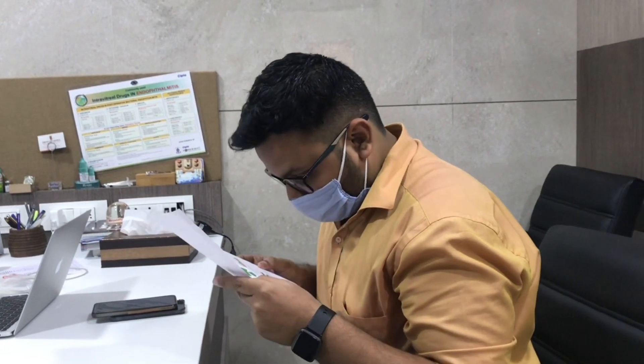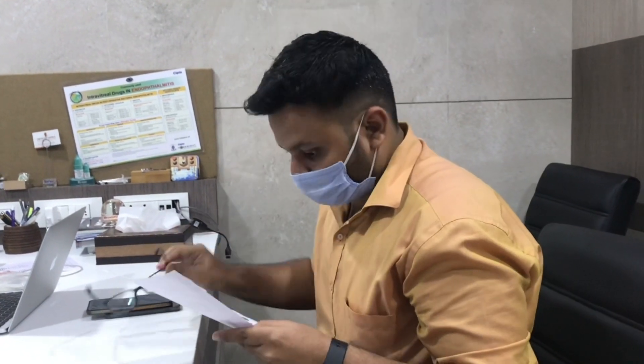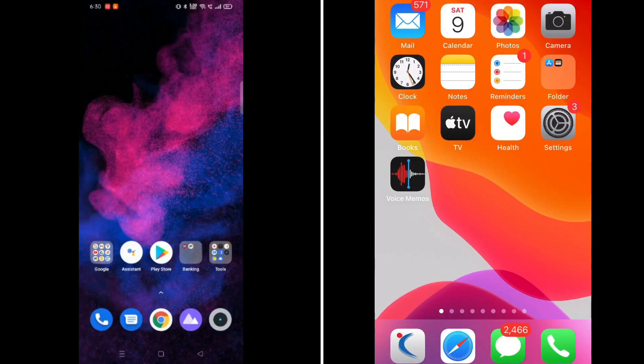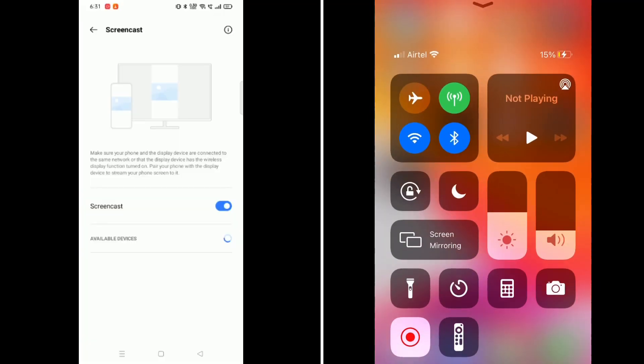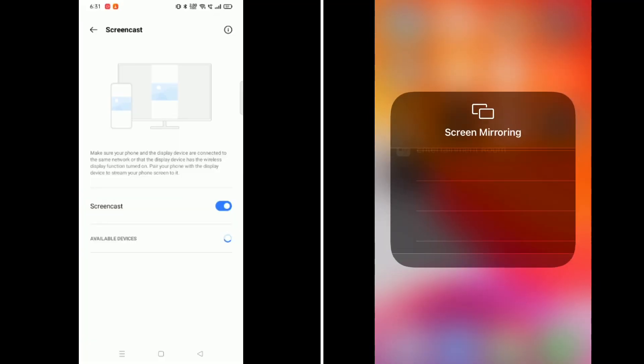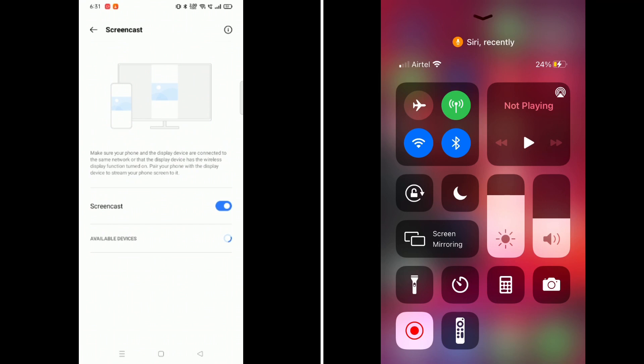So the answer to this problem is in your phone — phone mirroring or screen casting. Simply connect your Android or iPhone to a monitor, and that's it.